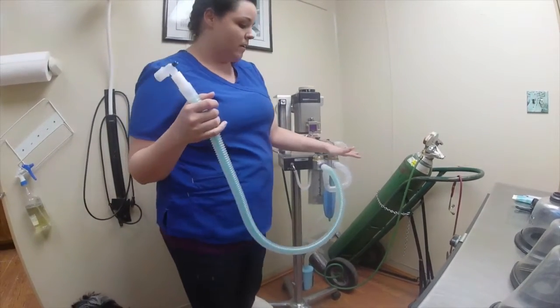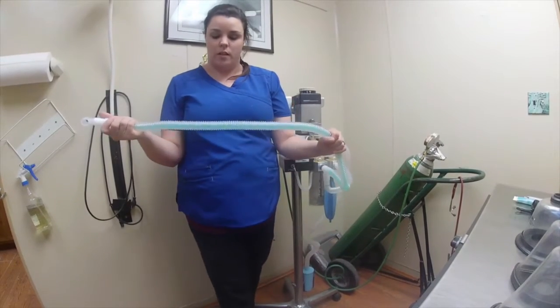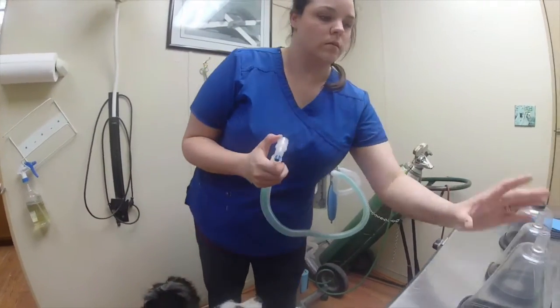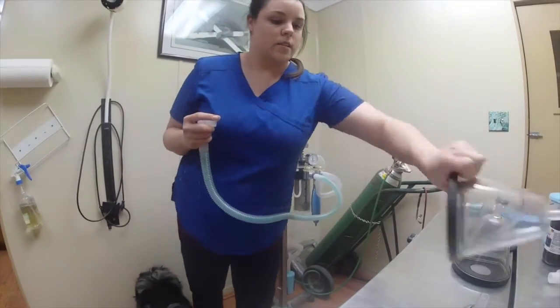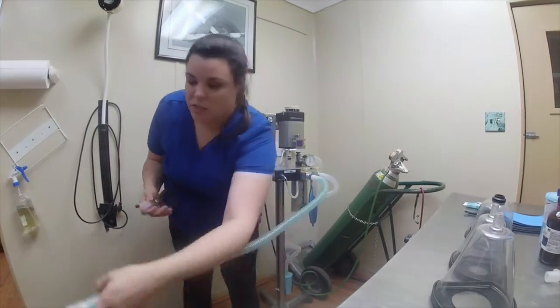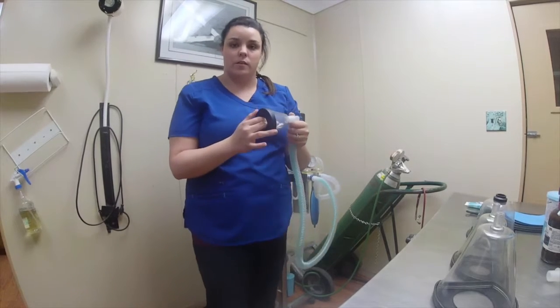This is our exhale tube and our inhale tube on our non-rebreathing machine. So when you are hooked up to an animal, you will have a mask. Depending on the size of your patient, technically, since it's a small bag, you would have a smaller animal hooked up to it. You hook it up, you would stick their muzzle into here.